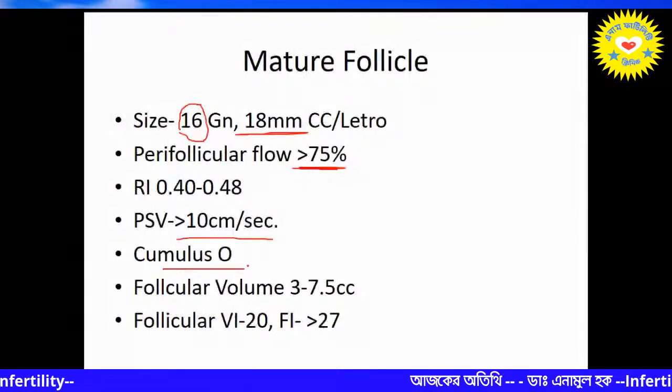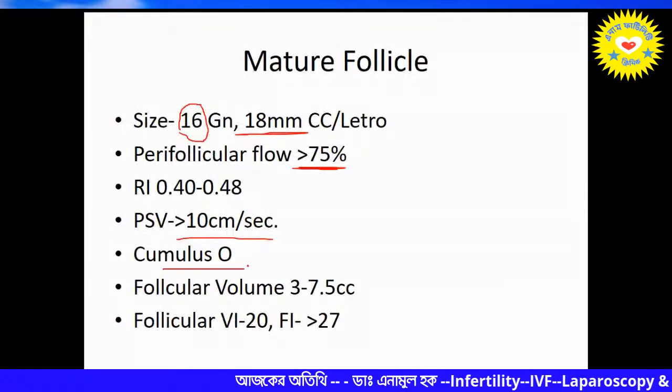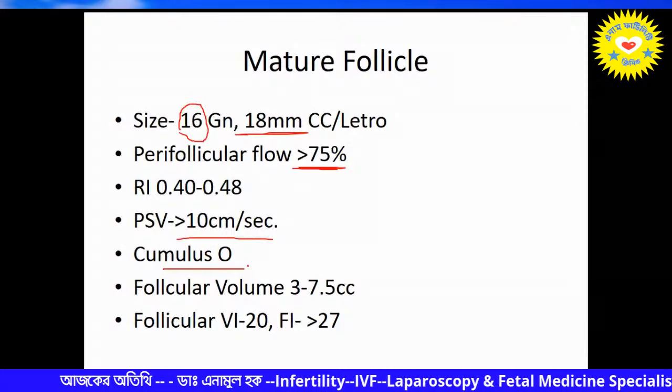These are the signs actually we will see whether this follicle is matured or not.